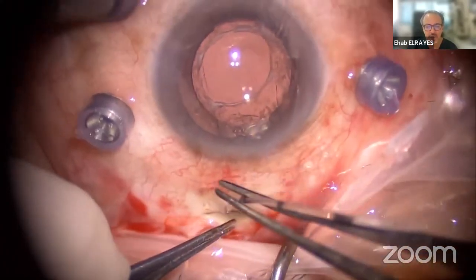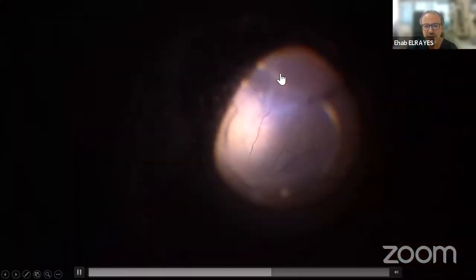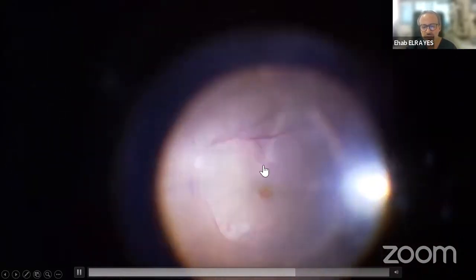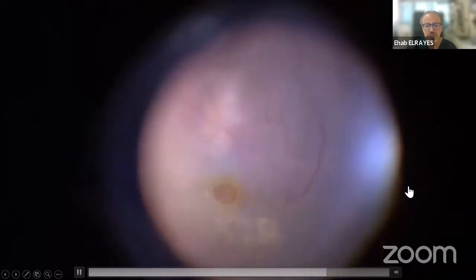of the eye. You glide the catheter by pushing on the sclera, and you can see the catheter moving in the suprachoroidal space all the way to the back part of the eye. Once we are underneath the target tissue, you start to inject, and you can see the choroid lifting, creating a scleral macular buckle, but it is theoretically a suprachoroidal macular buckle, and you can see flattening on table of the macular hole. So this is while using the non-illuminated catheter.